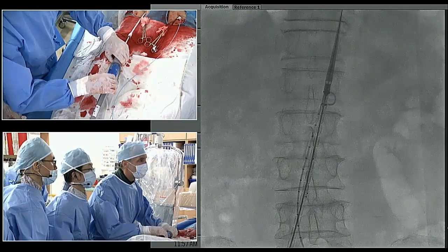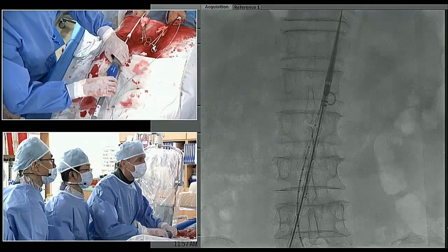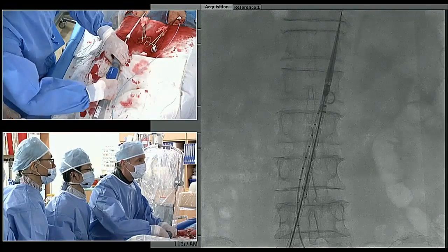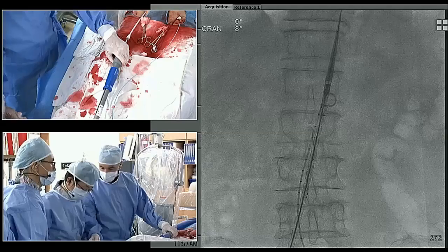It looked like the left renal was just slightly lower than the right. Yeah, we think that's correct. So may I ask again what size device in terms of diameter? It's 25, I think. 25. Let's go magnified ones.